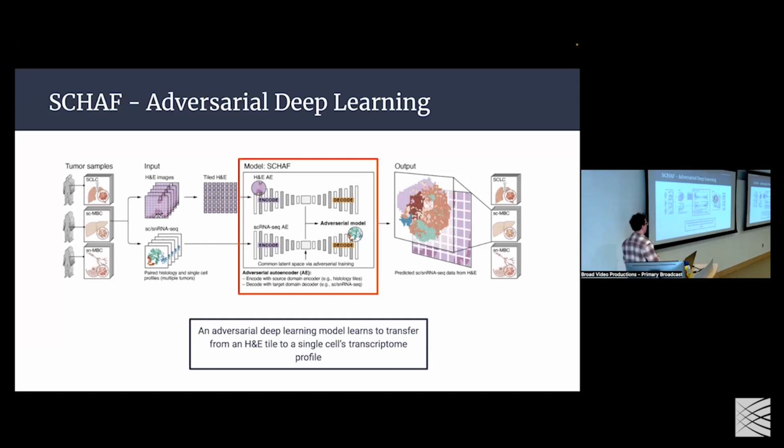More or less, how that's done is that you'll have one autoencoder that just learns to reconstruct, and then you'll have another one that learns to reconstruct, and additionally is kind of bullied into encoding to the same latent space as the first one. And then to actually do the transfer, we now have these two models that encode to a similar latent space. If you want to go from one of these H&E tiles to a transcriptomic profile, you can take the encoder of one model.